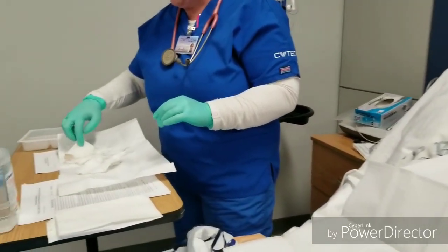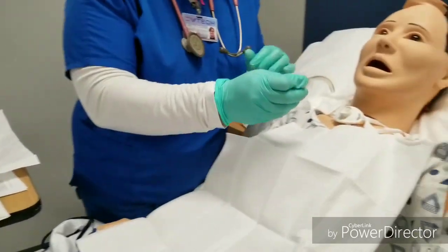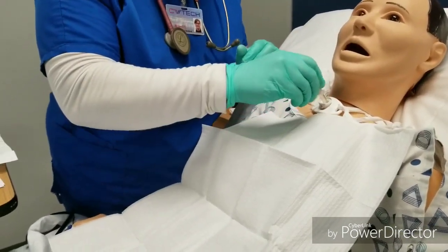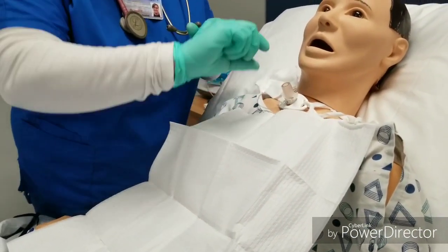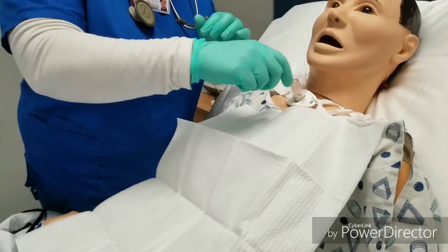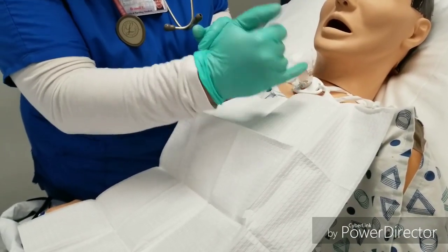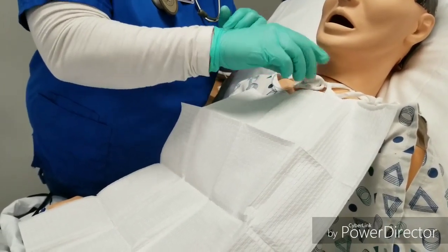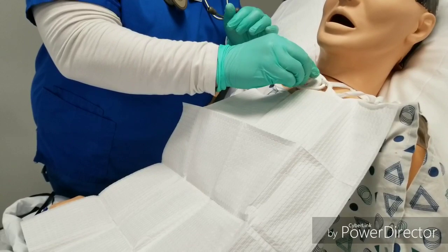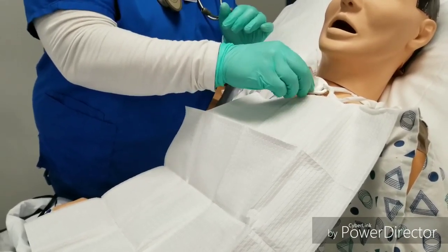So now we're going to place this back in, drop it in, and some of these will turn to lock in place. They'll have a dot down here and a dot on the cannula, and you want to line up those dots. This one does not. It has these wings, and you pinch them and then release once you push it down.